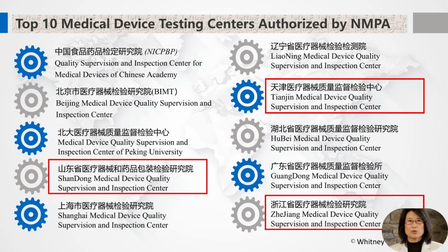When deciding where to conduct testing, manufacturers need to choose a lab that has been accredited and authorized by NMPA. Here are the top 10 medical device testing centers authorized by NMPA. These centers all have had many years of experience testing a large variety of medical devices, but each still has its own unique expertise.